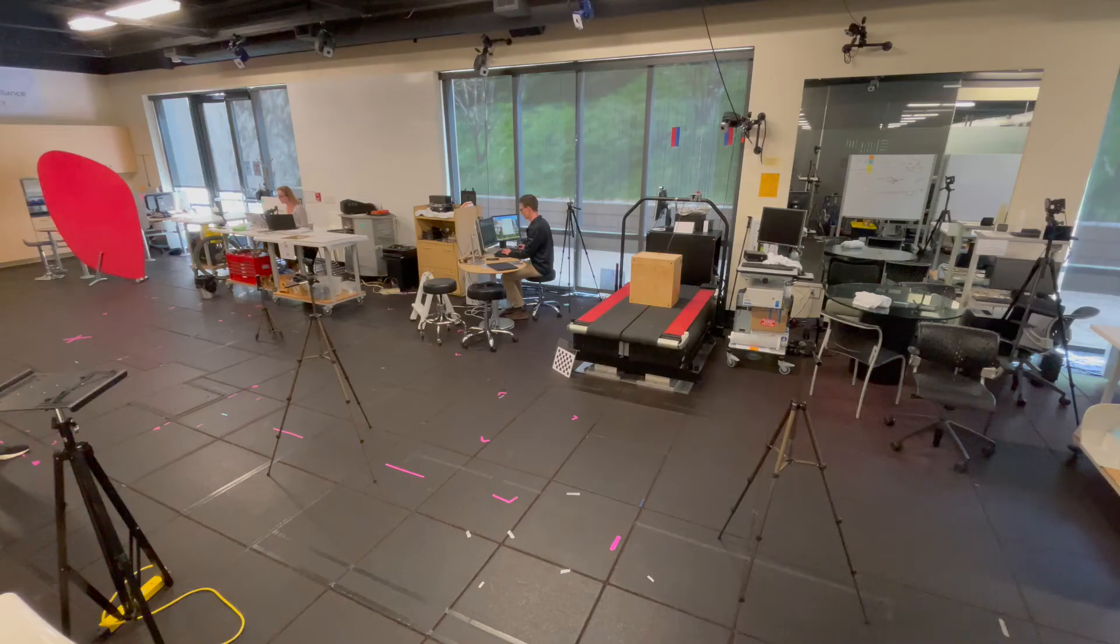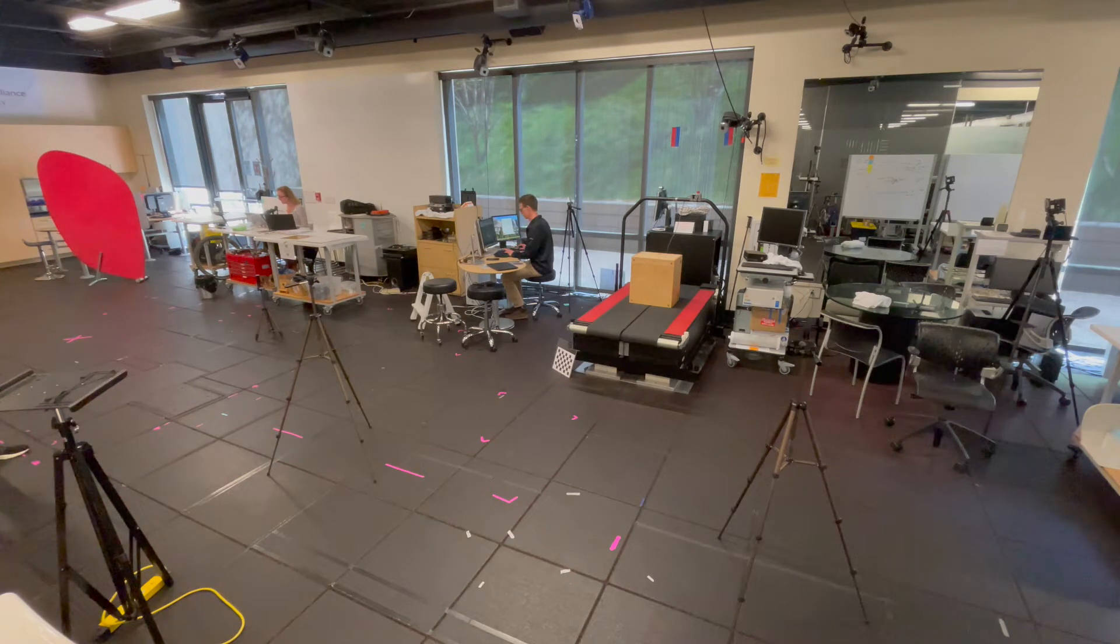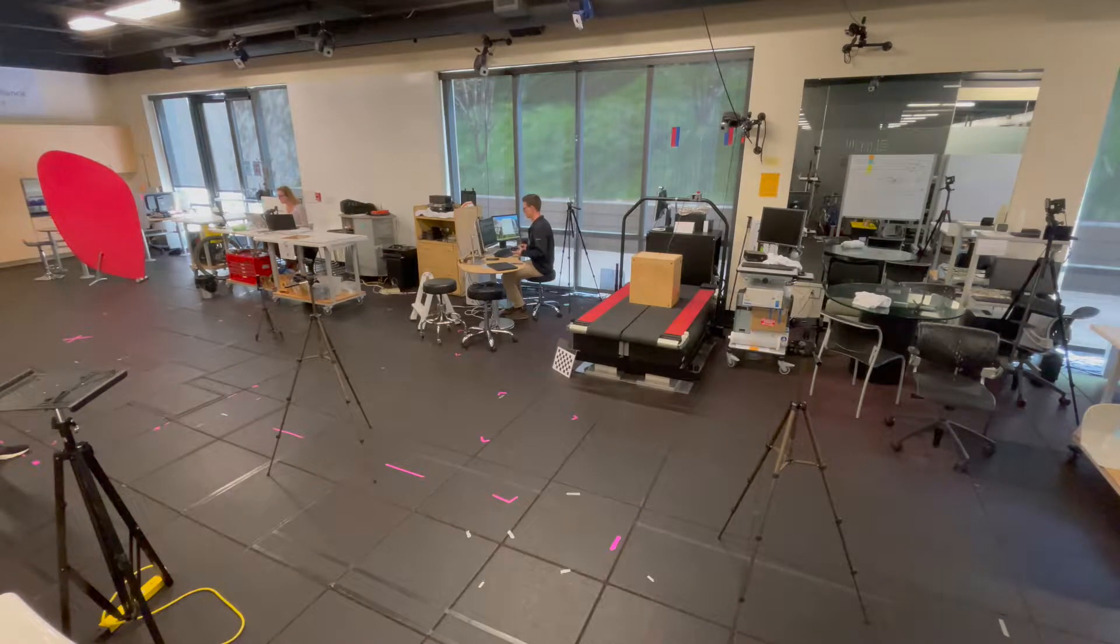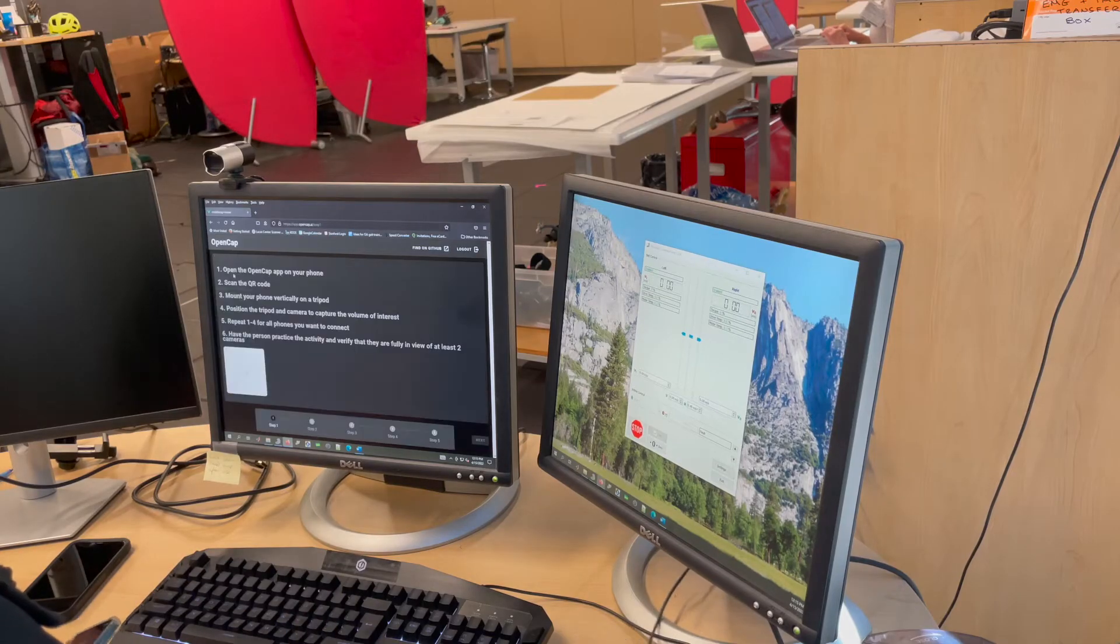To prepare for an OpenCap data collection on the treadmill, first log in to the OpenCap web application and start a new session. You will be given a QR code.